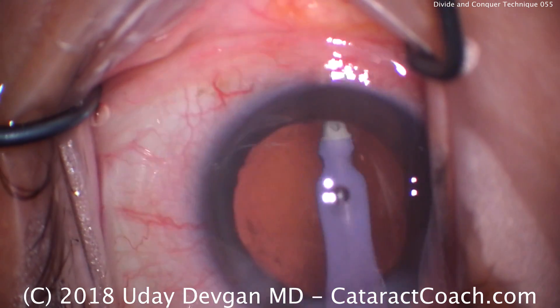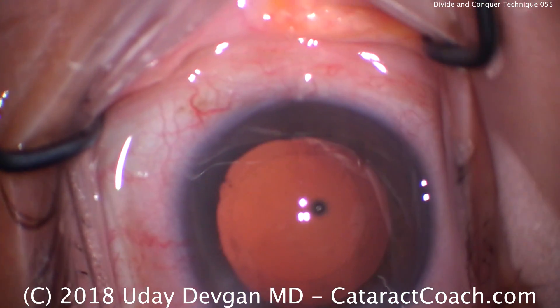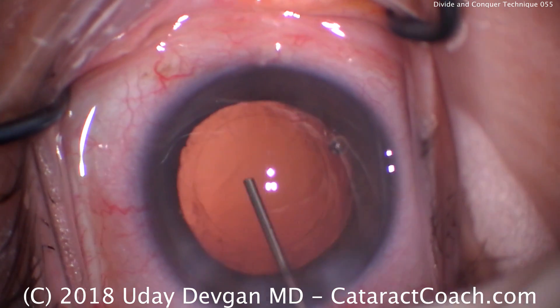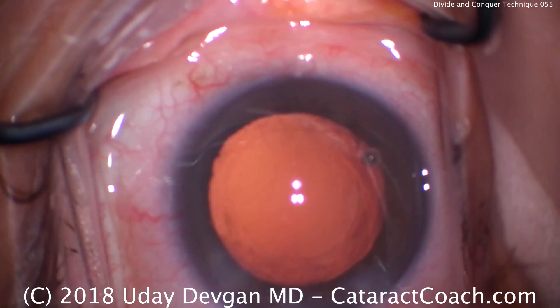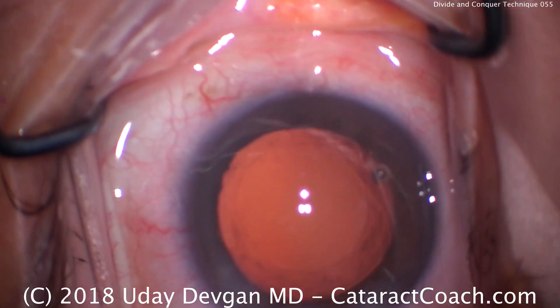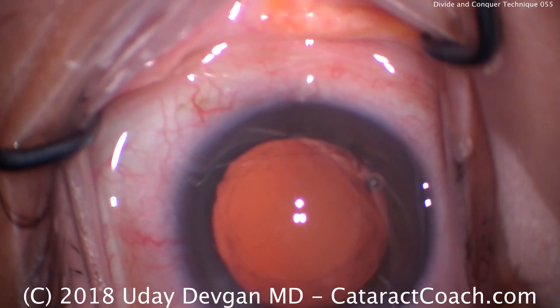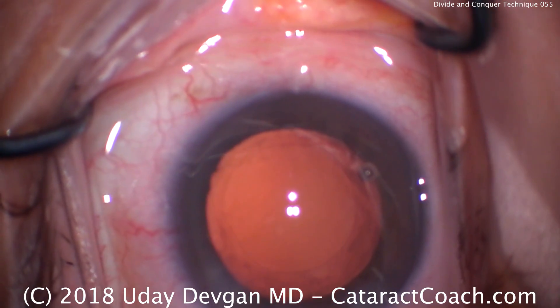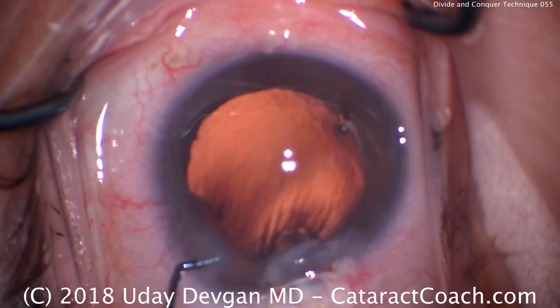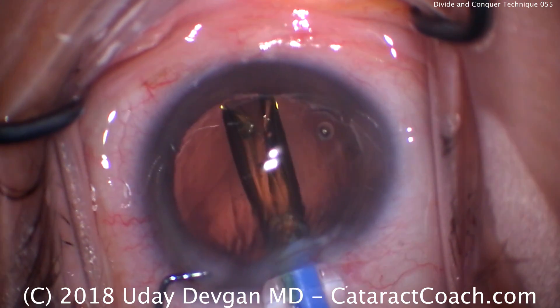That looks beautiful. In this case we're going to put a single-piece acrylic lens in the bag. We'll fill the capsular bag with cohesive viscoelastic — this one will be easier to remove at the end. In this case there's not quite enough viscoelastic left because the technician used it a little excessively, so the eye is a little softer. Normally I'd like a bigger fill of the anterior chamber. The globe is a little soft — advance the lens, it goes under the nasal rhexis.